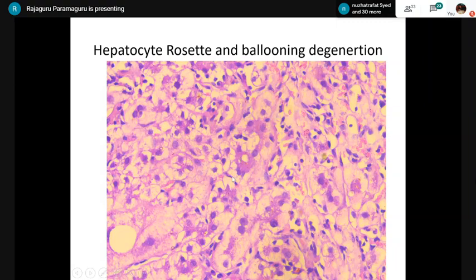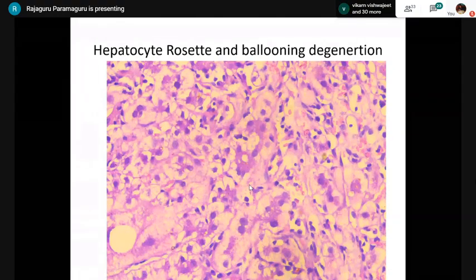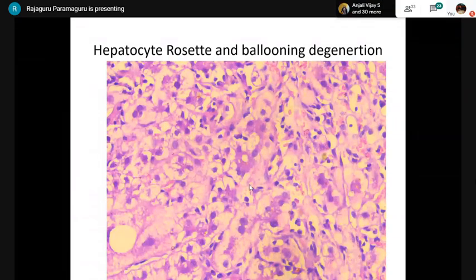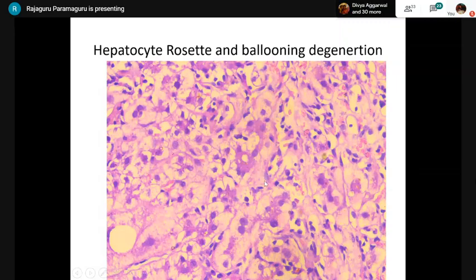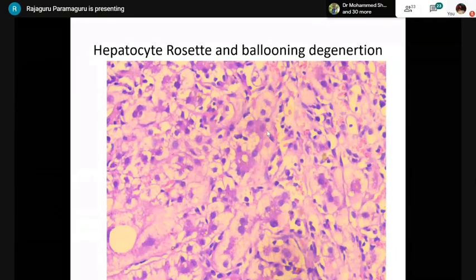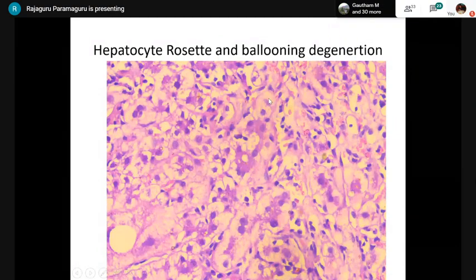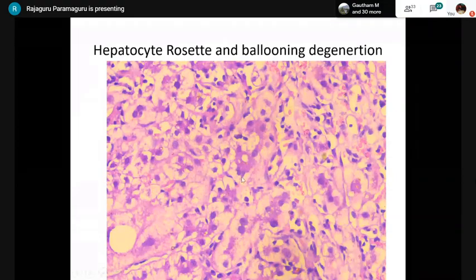Hepatocellular rosettes do not signify autoimmune hepatitis — they can be seen in any condition causing acute hepatitis, whether drug-induced or viral hepatitis. Ballooning degeneration is a degenerative change in acute hepatitis where the cytoplasm becomes granular and vacuolated — this is completely different from the ballooning change seen in steatohepatitis.